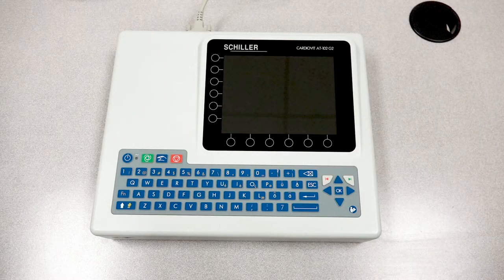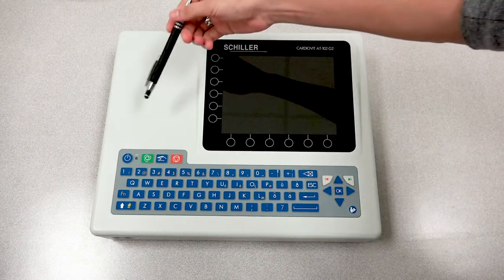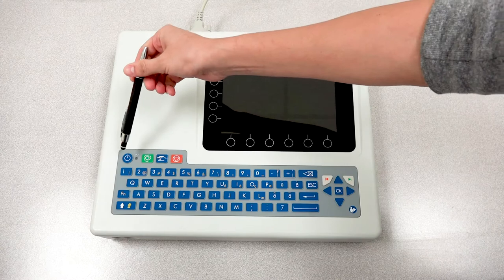Hello everyone, we'll be going over the basic functions of the AT102G2. If you notice the top left corner of the keypad, you will find your power button.